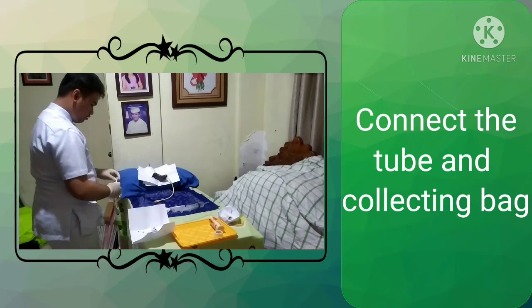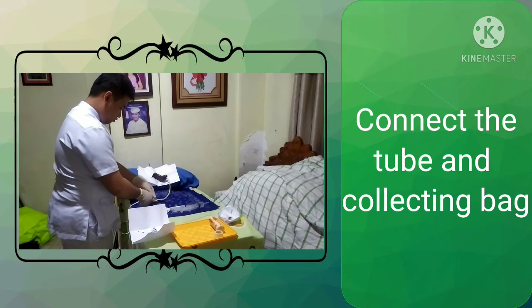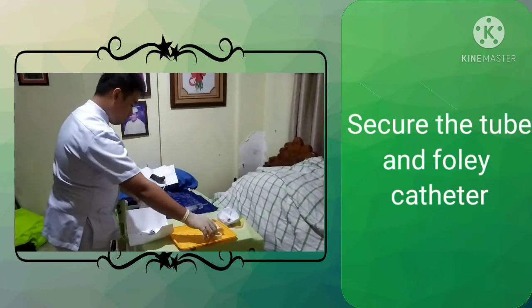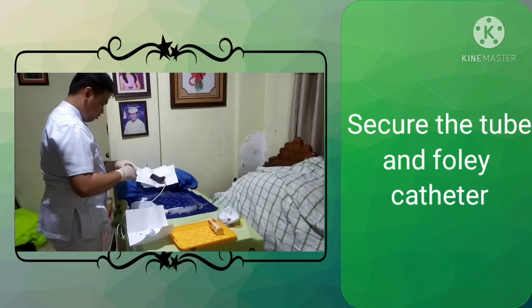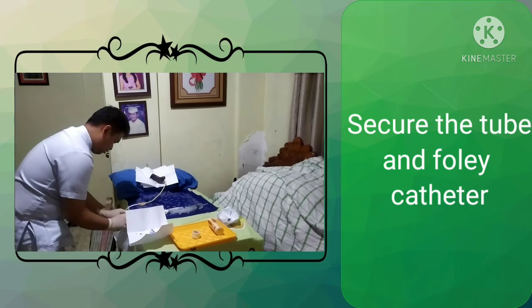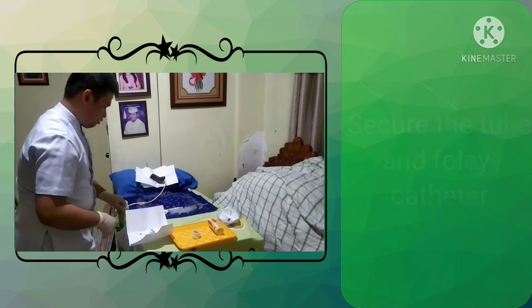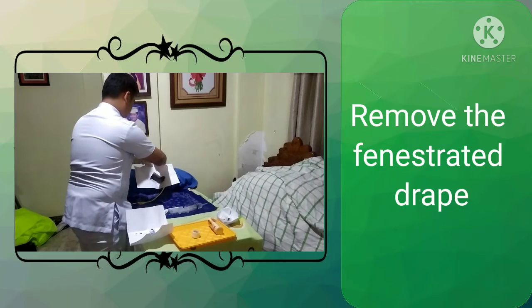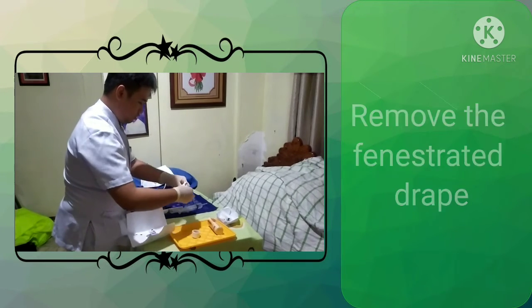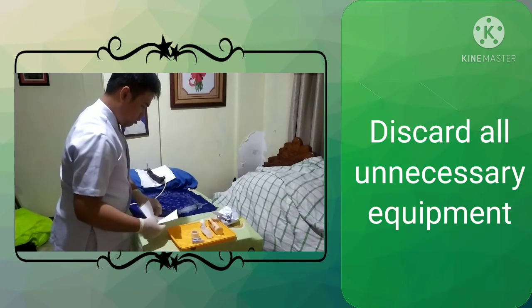Connect the tube and the collecting bag to the Foley catheter. Secure the tube and the Foley catheter with the commercial tube holder if available. If not, use medical tape. Remove the fenestrated drape. Discard all unnecessary equipment.